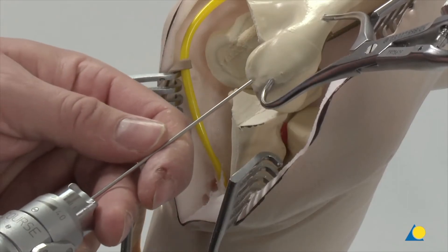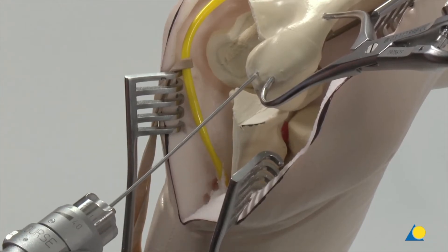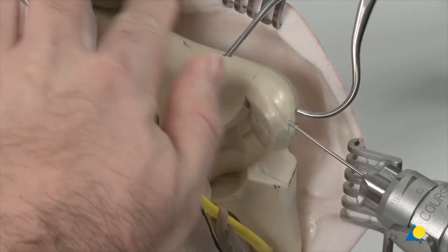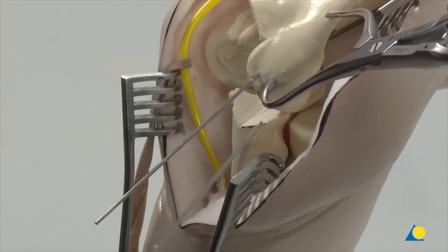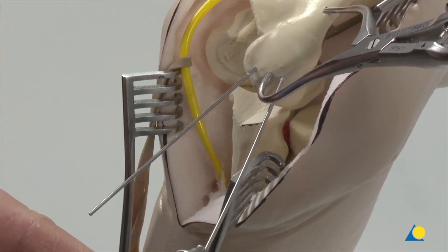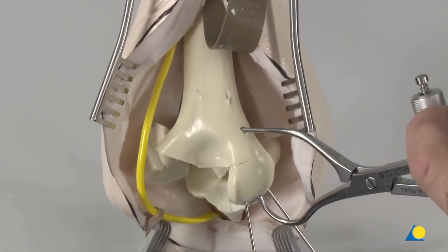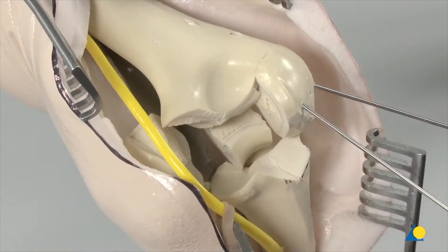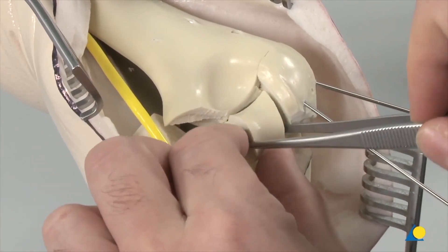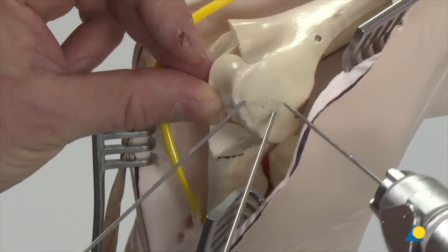The next step is temporary fixation of the reduced fragment using K-wires. When positioning the K-wires, it is imperative that the definitive position of the plate is taken into account to avoid any conflict between the plate position and the K-wire position. The forceps are now removed. The intermediate fragment is reduced next, positioned into the articulation, reduced anatomically to the stabilised radial column fragment, and preliminarily fixed in position with a K-wire.